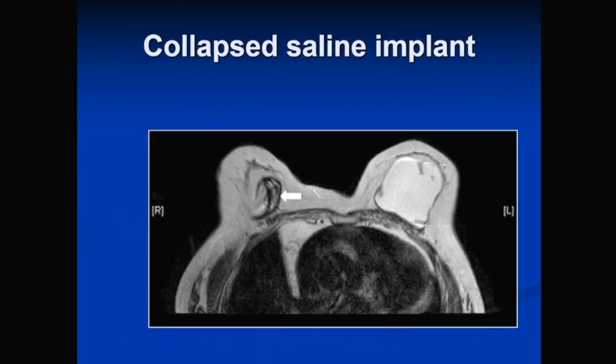A collapsed saline implant does not require MRI. You simply see the shell, as the fluid is completely absorbed into the breast. An MRI is not indicated in this setting — this image is shown only to illustrate what a collapsed saline implant looks like.